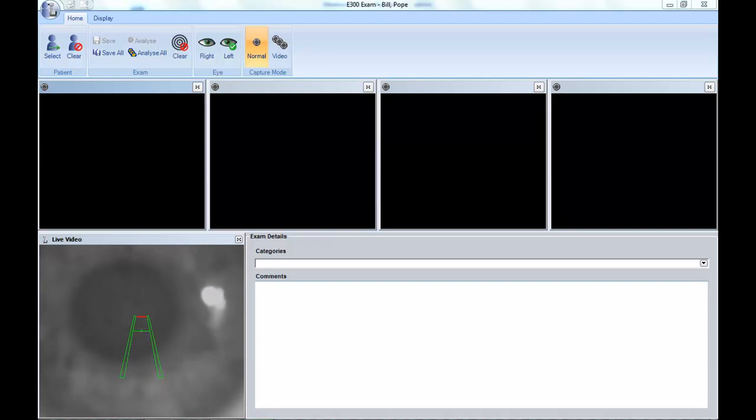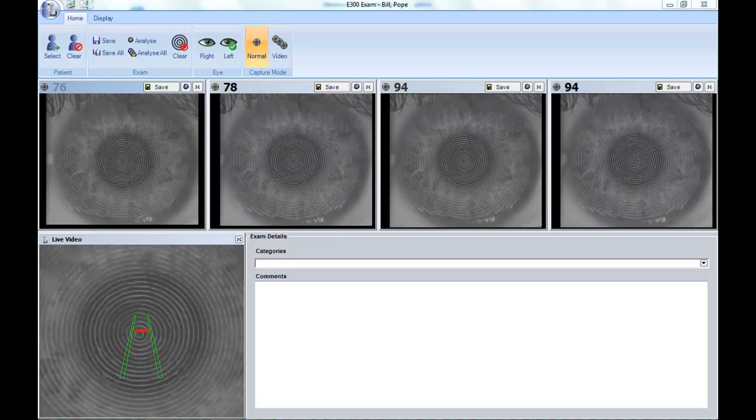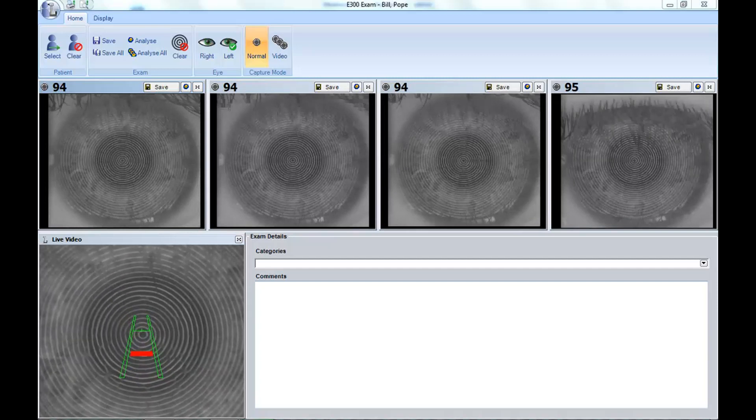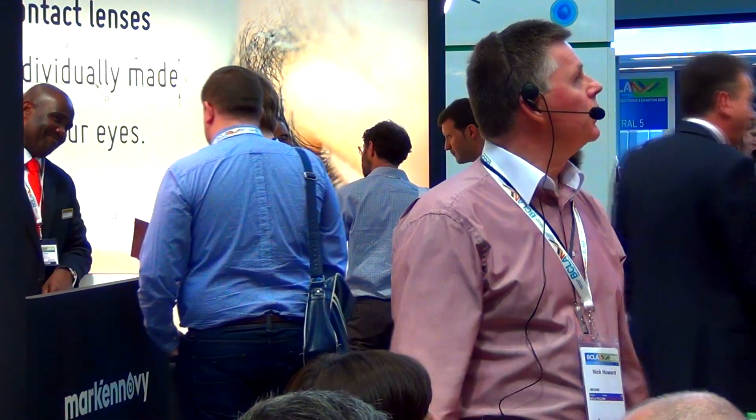Topography is just like landing an aeroplane. We've got a green cross line and a red target line, and as soon as the two are aligned together, you'll see the topography starts taking images very quickly indeed. Can you see these mires, and can you see how quickly they're breaking up? Because that is the pre-lens tear film, and this very much mimics conventional dry eye, so anybody doing dry eye management, this is a hugely useful tool.